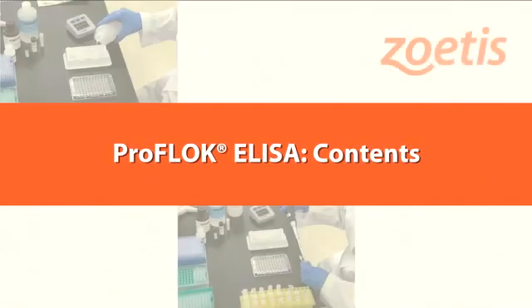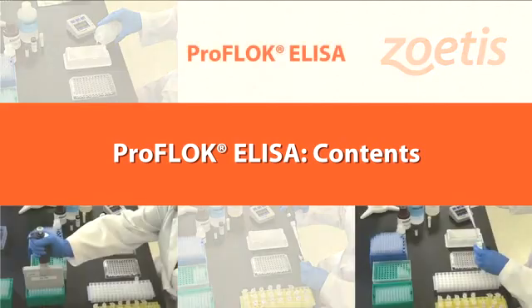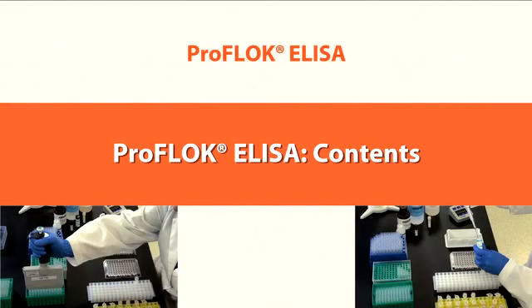The following items are packaged in each ProFlock ELISA test kit. The specific quantities listed are sufficient to run 90 tests or one 96-well plate. Be sure to refer to the directional insert that accompanies each test kit for exact content details.